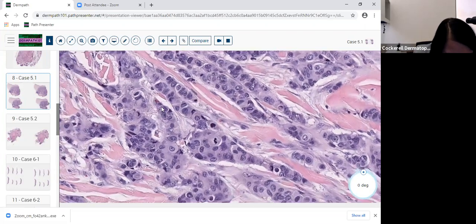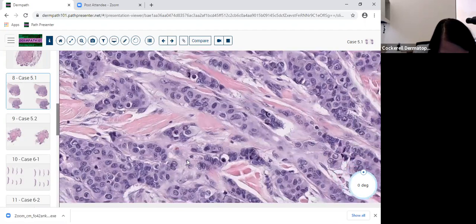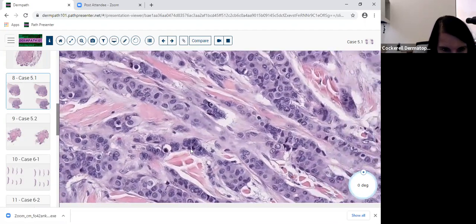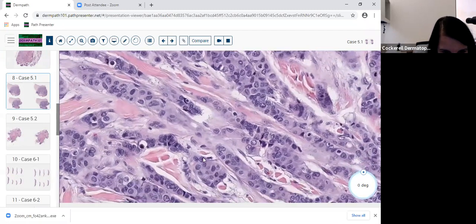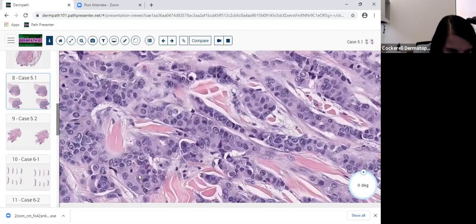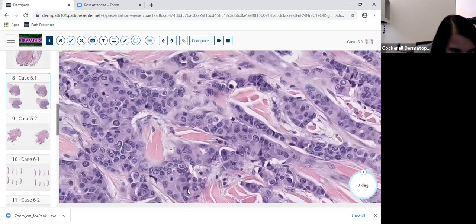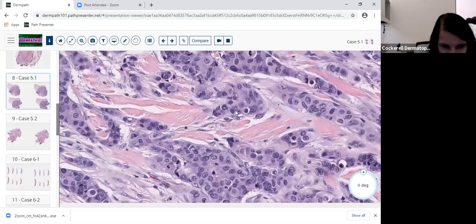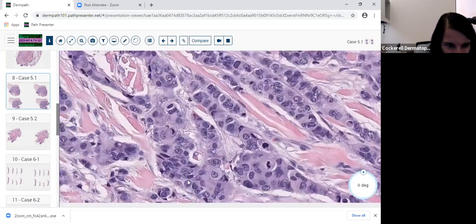Here's some reds clumped, but look around for a lymphocyte and compare a normal cell to the size of these nuclei. And you'll say these are huge, huge cells. I mean, they're huge and their NC ratios are high and there's tons of mitoses and there's nuclear pleomorphism, high grade nuclear atypia. This is classic for it.